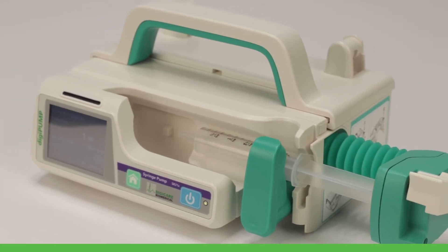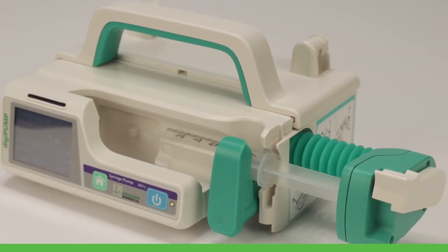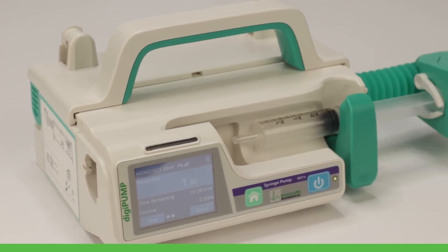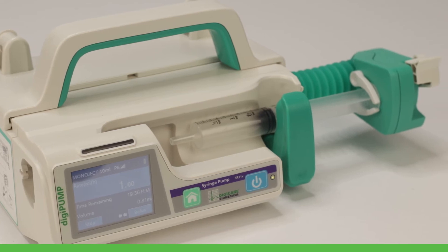As with all DigiCare products, the DigiPump SR31X is easy to use, incorporating an auto calibration method that can be used with any standard syringe at your clinic.